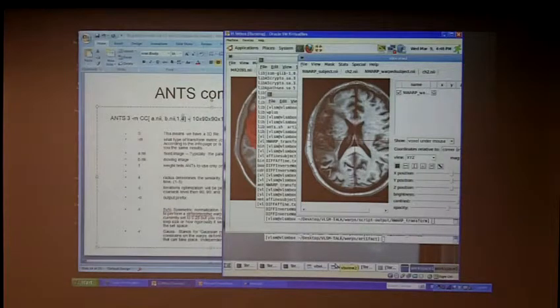And each of these takes 1 to 2 hours, down from 8 in the original. Lately it's been going more like 45 minutes. So that's the full sequence from beginning to end. I was going to say the cluster has improved over the last couple of years. It's not ANTs itself that has improved, it's the program itself. The program to apply the transformation takes no time at all.